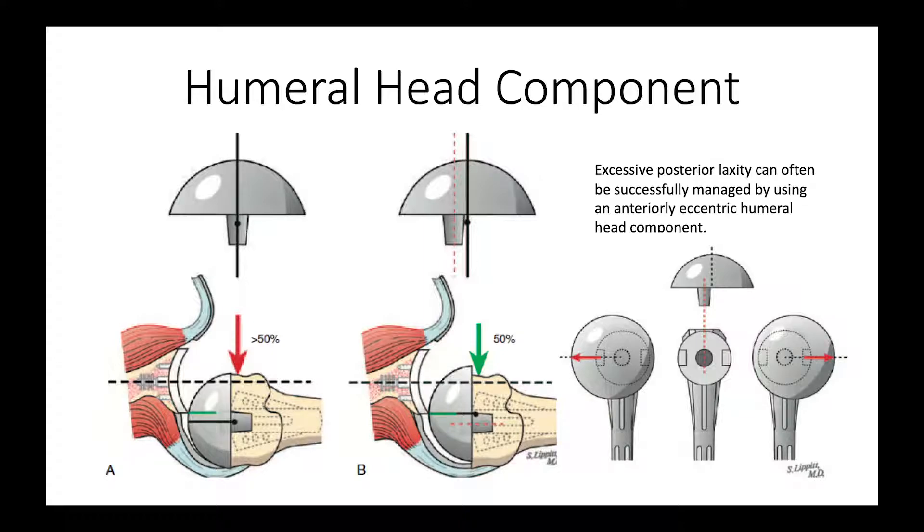We have the advantage of modulating the laxity once we have the glenoid component in place. We can do that by increasing the thickness of the humeral component or by using an anteriorly eccentric humeral component, as shown here and here.